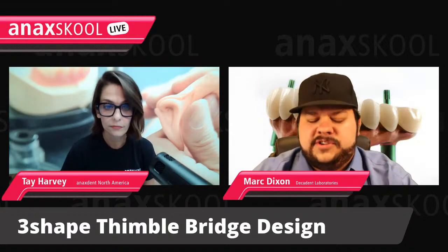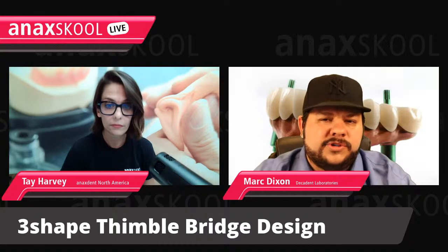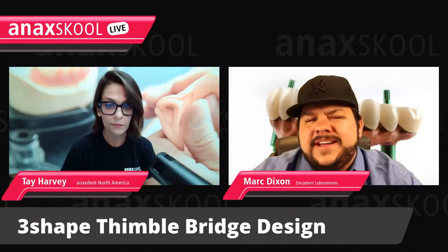So you probably already know the answer to this. But it's the same place we're always going to start. The most important part of the whole treatment plan. And that's the diagnostic wax up, right? So that's where I start.